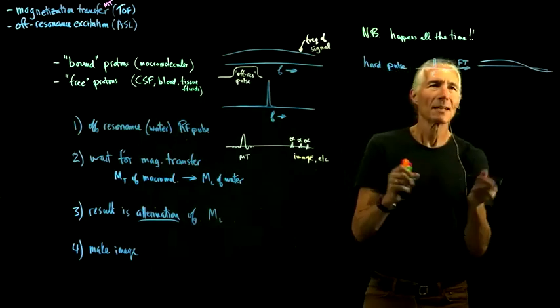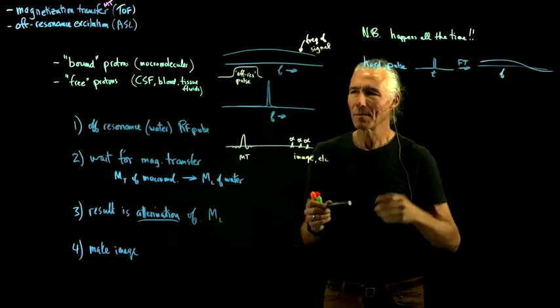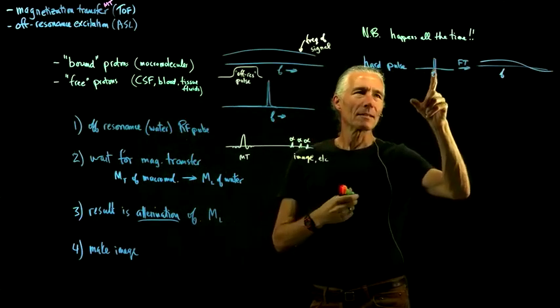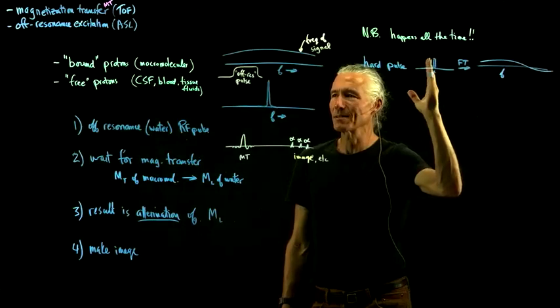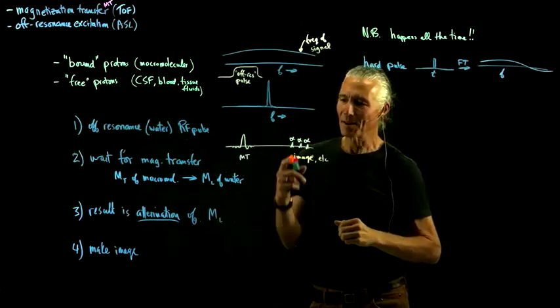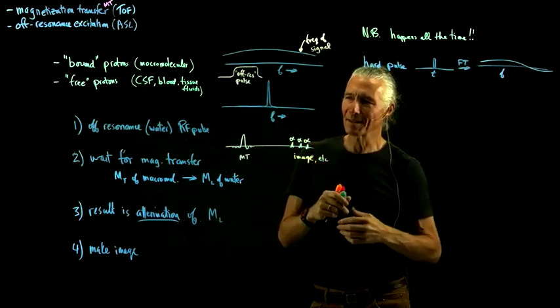What is everything? All frequencies. So isn't that an off-resonance pulse? It is. It's on resonance. You're aiming for the water. You're hoping that one of the middle frequencies is the water, but it's hitting all frequencies, and so it's doing magnetization transfer. So when you're doing the gradient readout, you've got a little bit of magnetization transfer in there too.